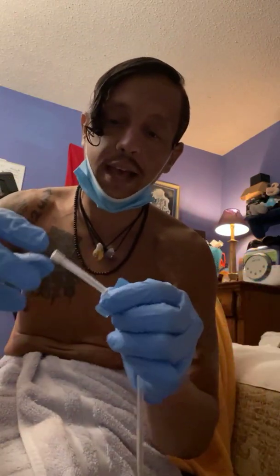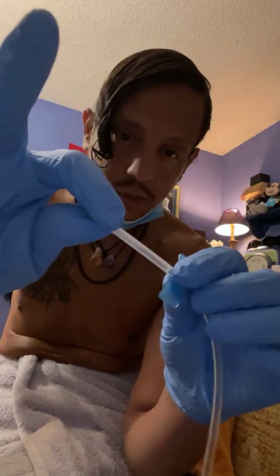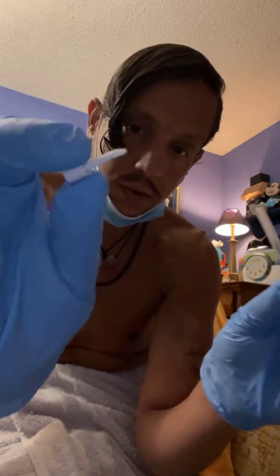So this thing is crazy, but first what we got to do is take the scabs off. So you see how this needle has this little top right there? We just pick that off, and it's a little scab remover. So first, let's remove the scab.